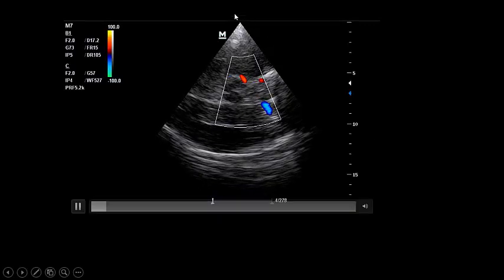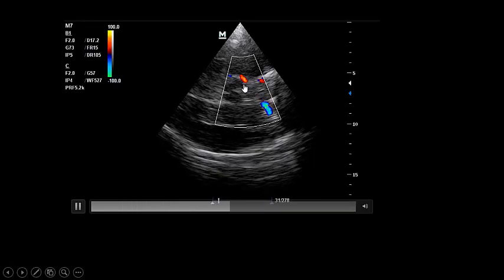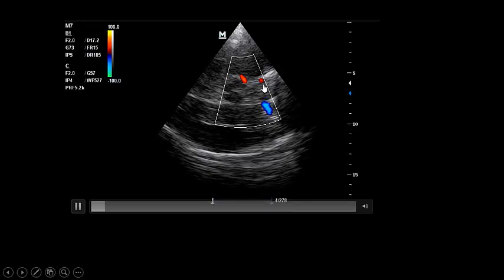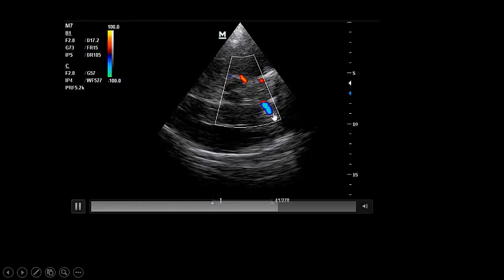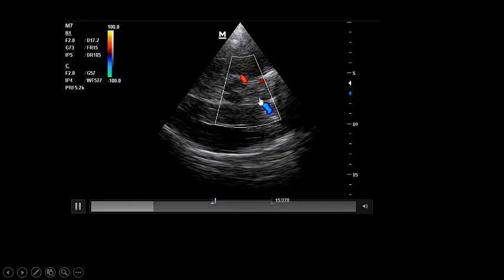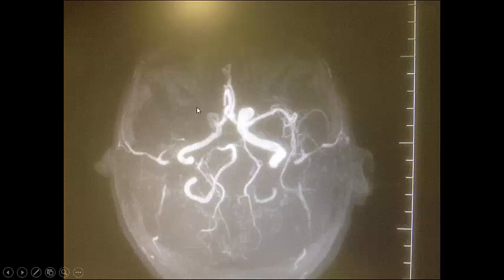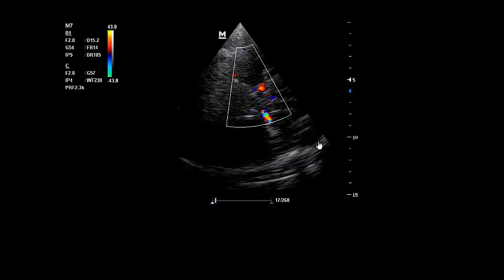On the right side, placing the phased array probe with the temporal approach, here is the brainstem butterfly appearance, posterior cerebral artery, and anterior. Along the anterior sphenoid wing, I did not see any middle cerebral artery flow — indicating complete obstruction of the right middle cerebral artery. There was also increased flow in the contralateral left middle cerebral artery. The gold standard to confirm this is cerebral angiography, which showed complete obstruction of the right middle cerebral artery — very clearly confirmed by TCD.